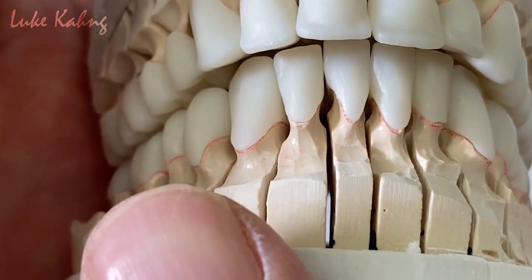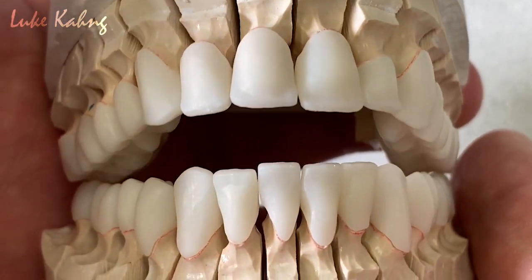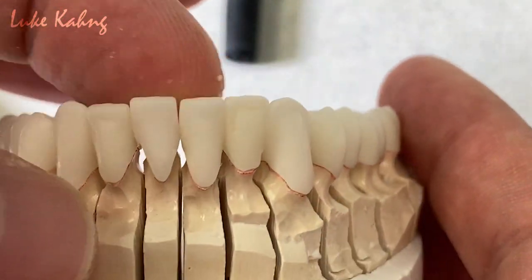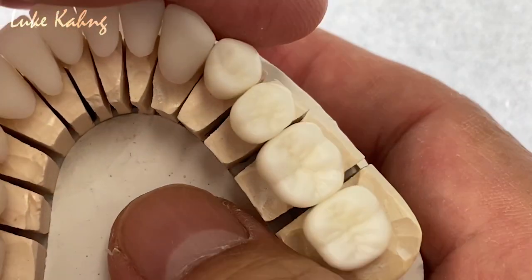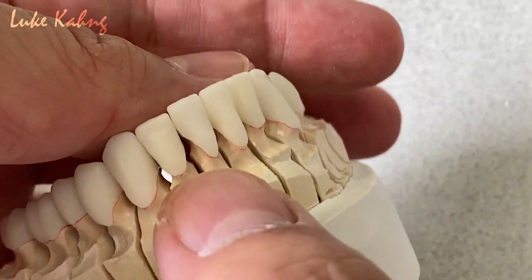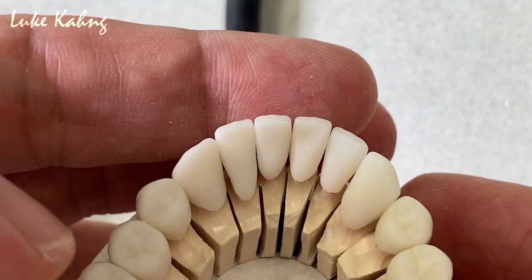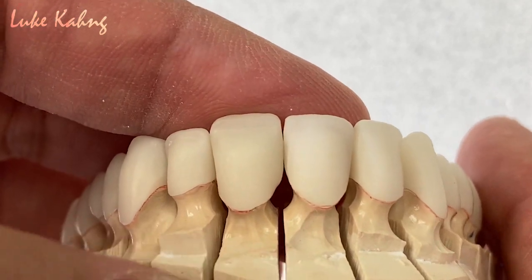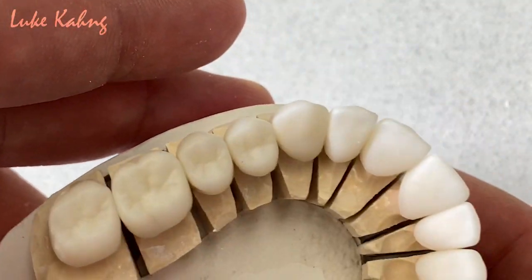Occlusion contact. And this is the zirconia framework. Proximal contact is right. And then occlusion is pretty good. This is monolithic to both sides. And then we just slightly cut back just a little bit, but full protection for porcelain chip. Here's occlusion as well. Okay, here's the side tooth.